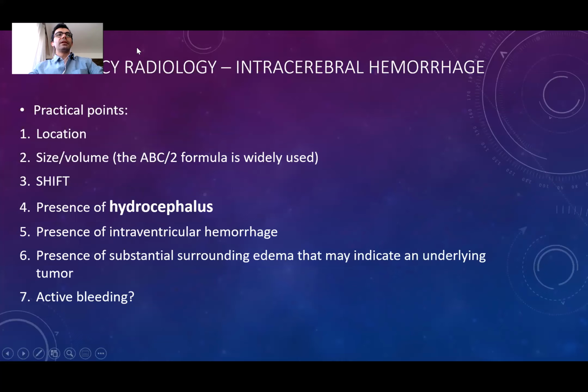So when you are seeing a patient with an intracerebral hemorrhage, there are things that you should consider in terms of radiology. You have to always pay attention to the location of the patient when you are referring to a patient.